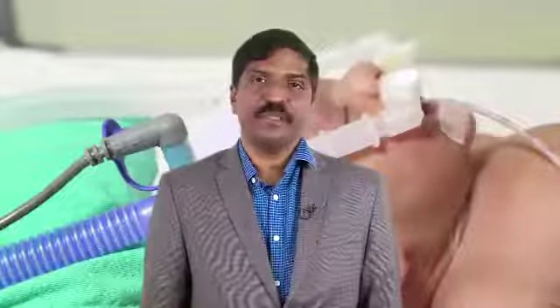The gas that exits from the water chamber is at a relative humidity of 100% at 37 degrees Celsius, and as the gas gets heated in the inspiratory limb, that is from 37 to 39 degrees Celsius, there is a drop in relative humidity. Again, in the last segment of the inspiratory limb, as gas temperature comes back to 37 degrees Celsius, equal to the temperature that exited the water chamber, gas reaching the newborn nares will always be 100% relative humidity.